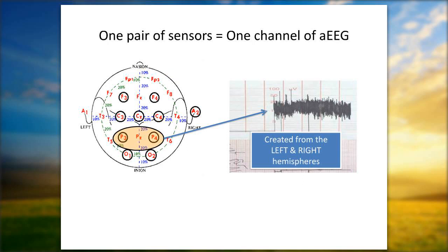In this particular slide, I'm highlighting the P3, P4, and this is exactly what I was getting ready to say. Regardless of where you place the other electrode, whether it's C3 or F3 or F4, you always have the ability to look at P3, P4. The advantage of P3, P4 is that's where all the normative data comes from. If you ever have anything unusual happening on one side or the other, you can always cross-check overall global health by looking at P3, P4.